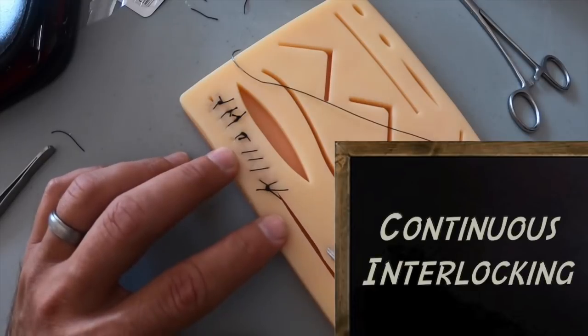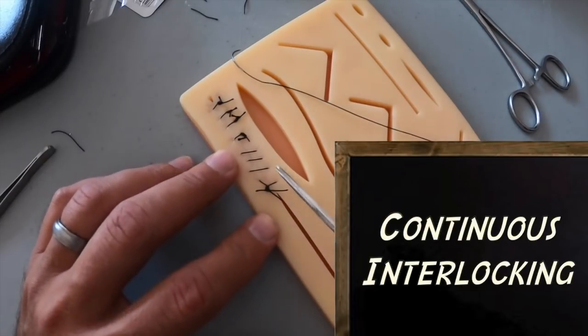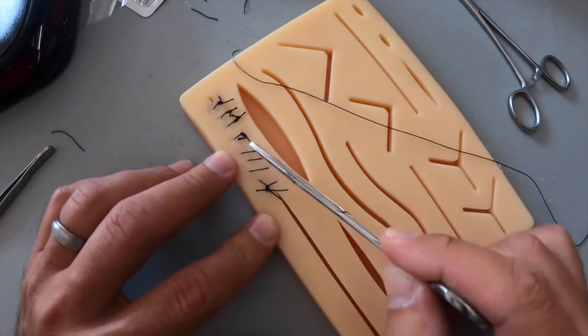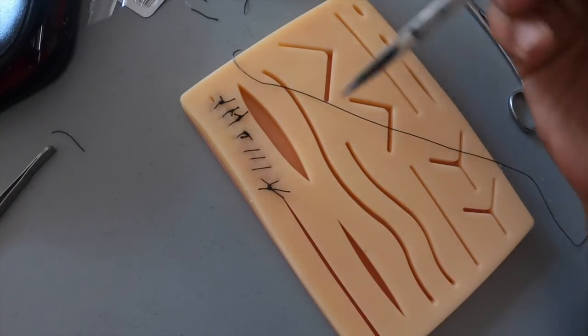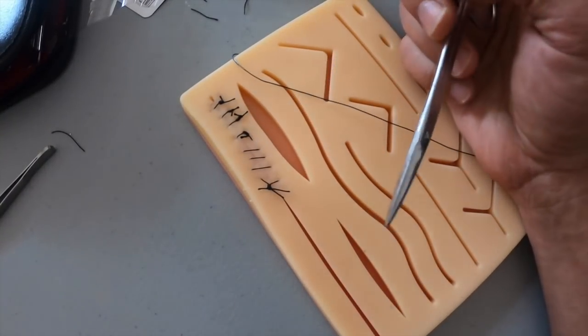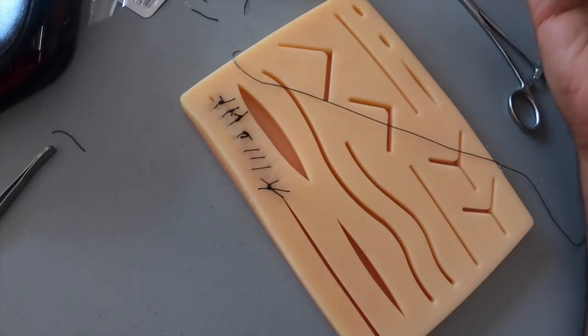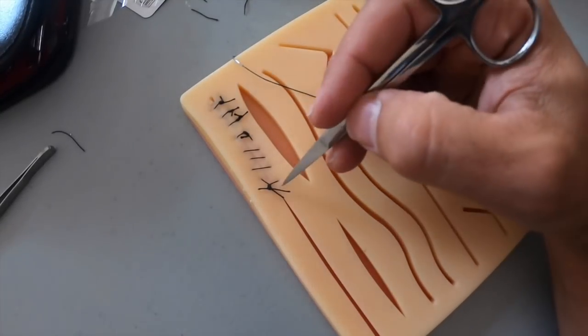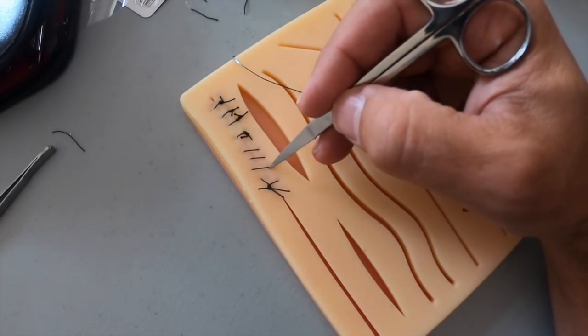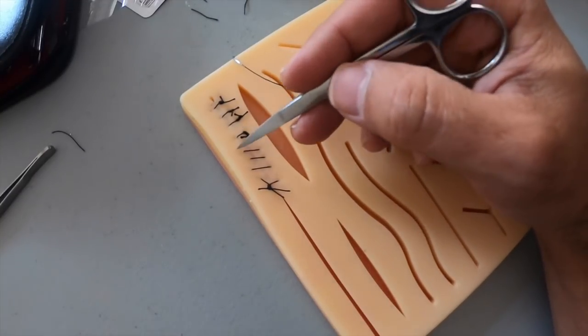Now we're going to do the simple interlocking. It's going to be just like this one, but each stitch is going to interlock to the next one. As I said before in the last video, the advantage of the interlocking is one, I like how it looks, and number two, it provides a great deal of hemostasis.